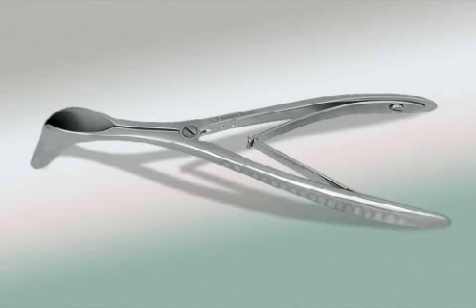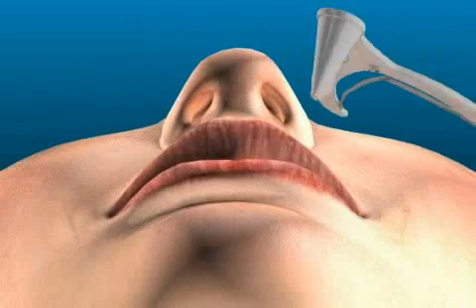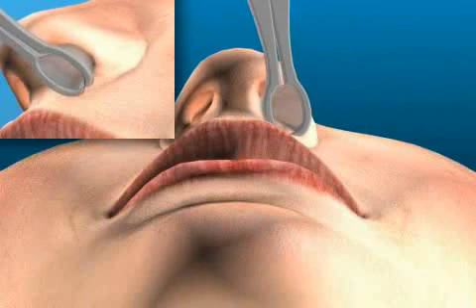The nasal speculum is an instrument specifically designed to assist in the spreading of the nose. The nasal speculum is most commonly used during throat, nose, and ear surgeries.